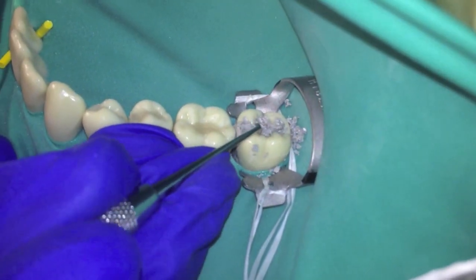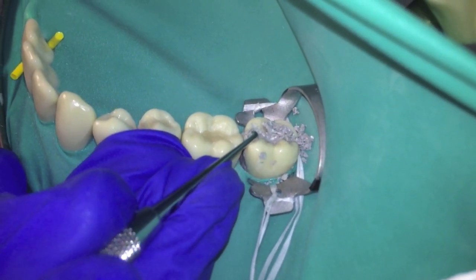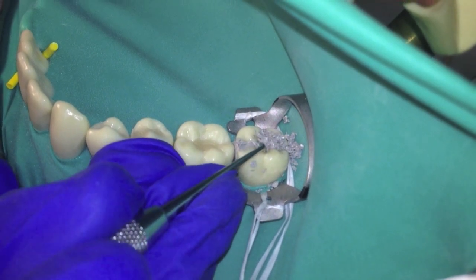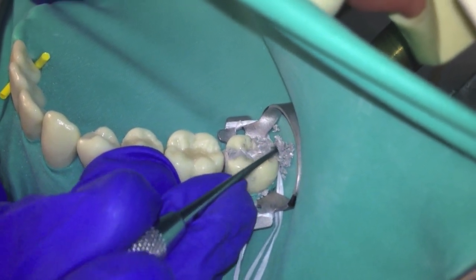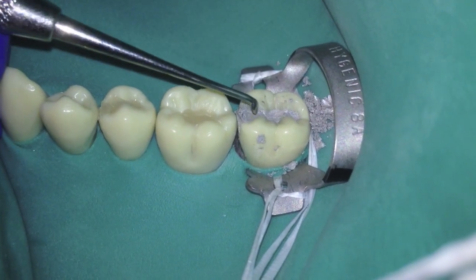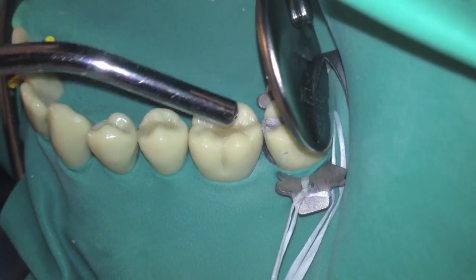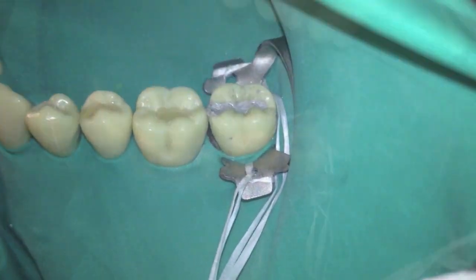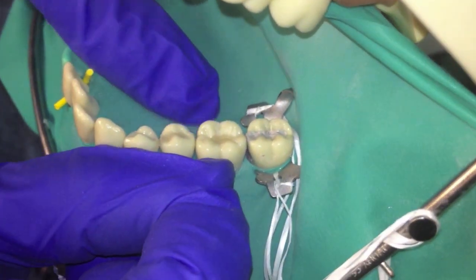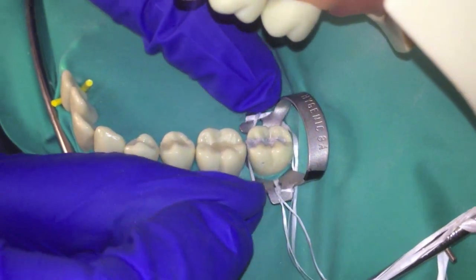Place the blade of the carver at a 45-degree angle towards the central fissure. Each cusp is carved utilizing the uncut portion of the tooth as a guide. Do not allow the tip of the carver to cross over the central fissure line while carving, as this will cause an error in anatomical form. Gently floss, placing the force against the adjacent tooth. Do not bring the floss back up through the contact.